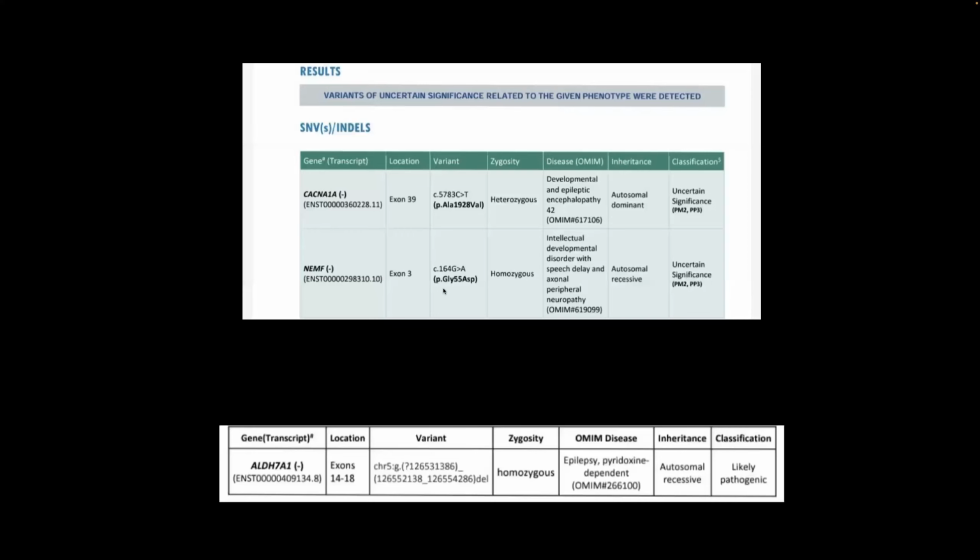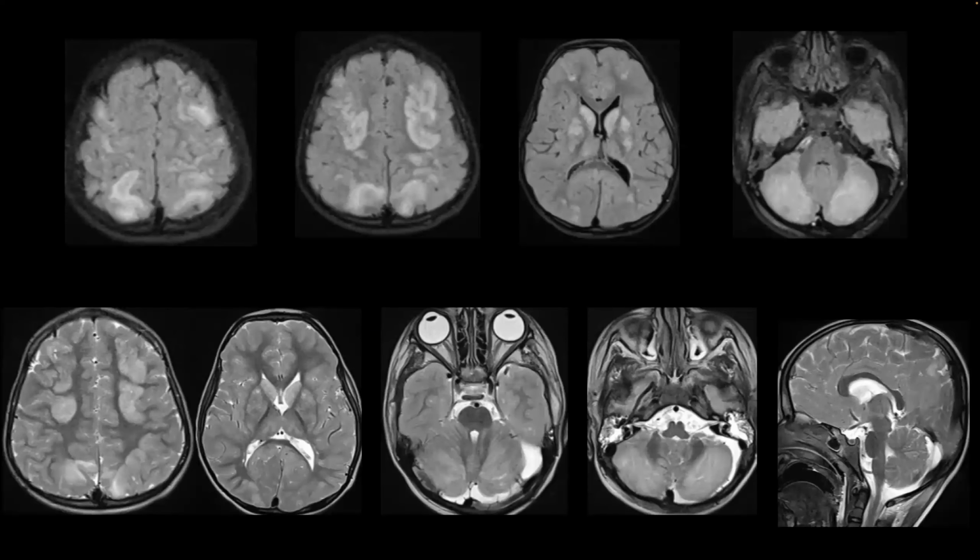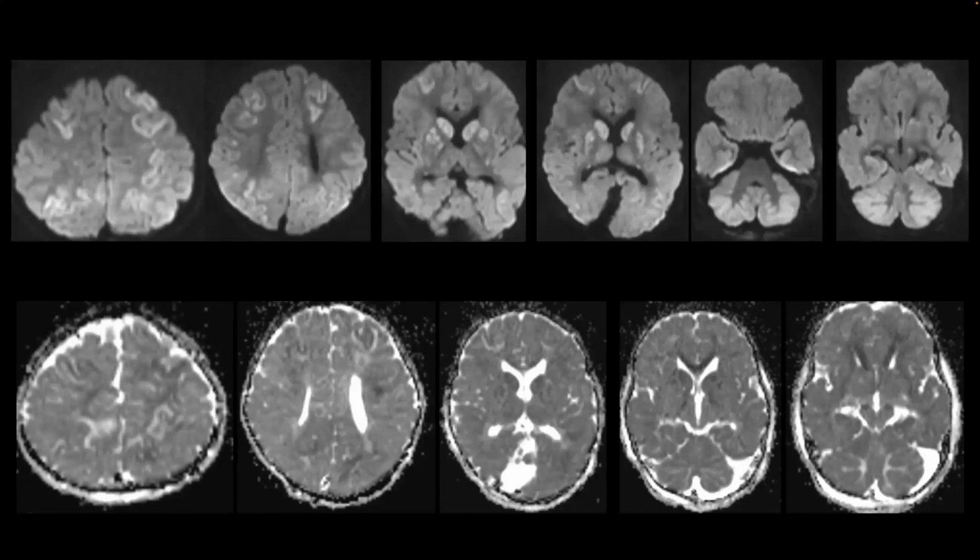Right. So this all could be just secondary changes, either the infectious process or the status. This has to be pyridoxine. And unfortunately, this atrophy has remained because of the sequelae to the secondary changes. Infectious process plus status must have caused this. There is cerebellar atrophy and both cerebral atrophy in the repeated MRI.